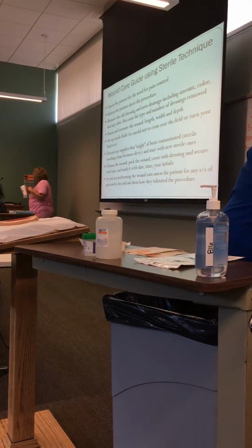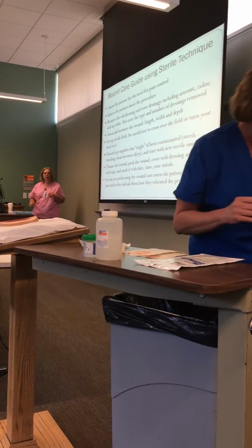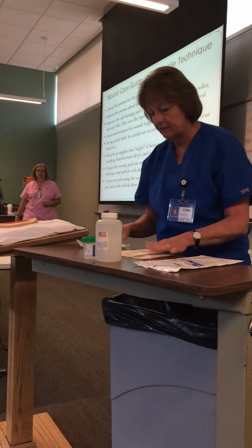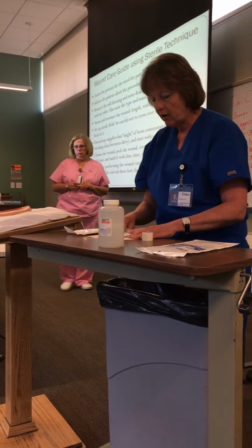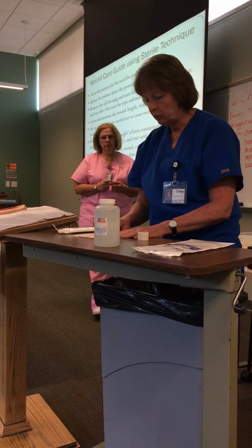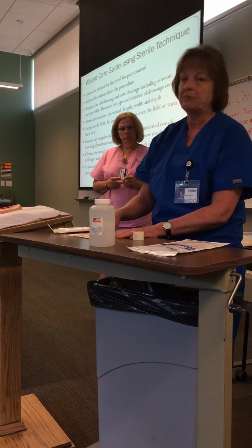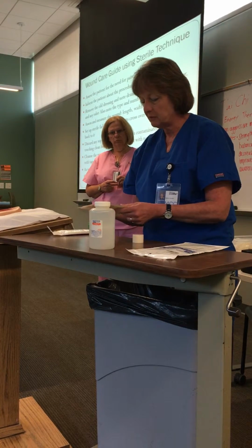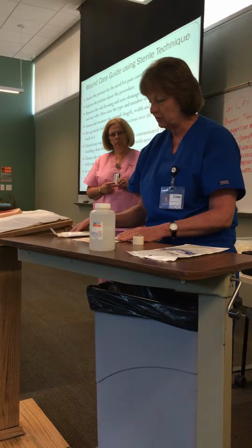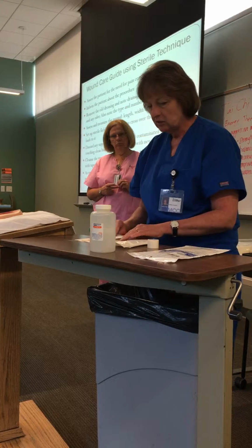So I'm going to take off anything that doesn't need to be on this tray table, because this is hard for you guys. A lot of times you've got so many things here, it's hard to imagine. We have to make sure that we can't just pour the solution right on top of the sponges, because it'll leak through. If we had the plastic bottom sponges, then we'd be able to pour the solution in. But for now, we're going to continue to just use these.